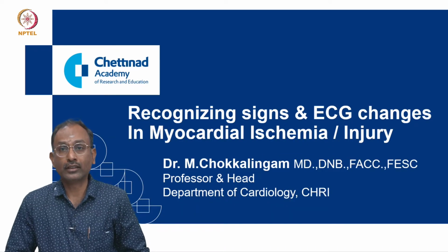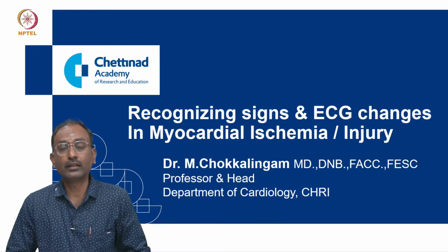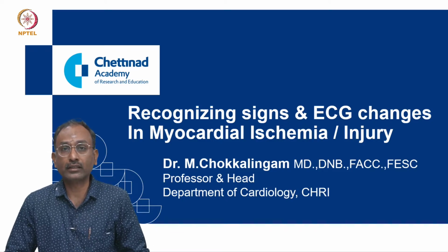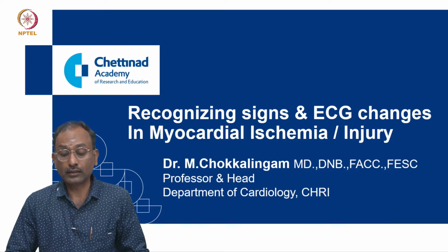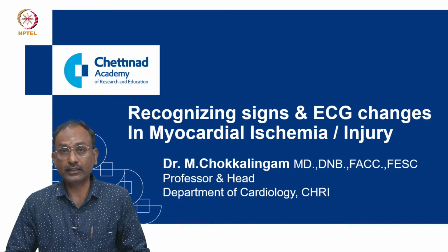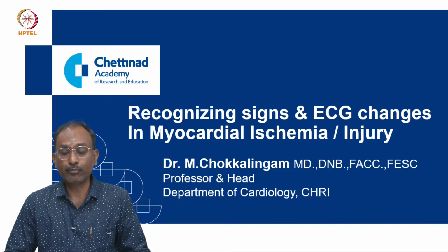I am Dr. Chokkalingam, Professor and Head of the Department of Cardiology, Chettinad Hospital and Research Institute. We are going to see recognizing signs and ECG changes in myocardial ischemia and injury.